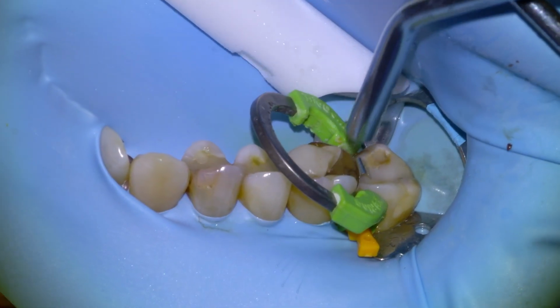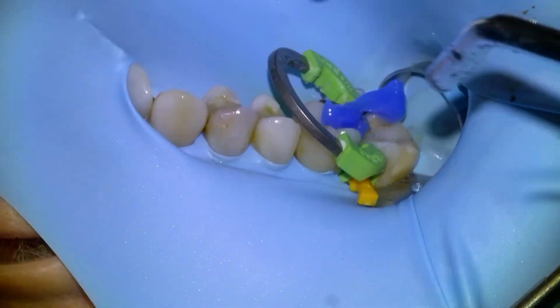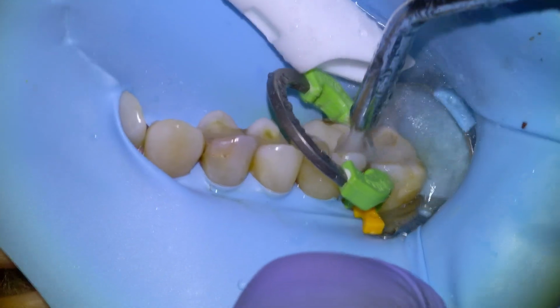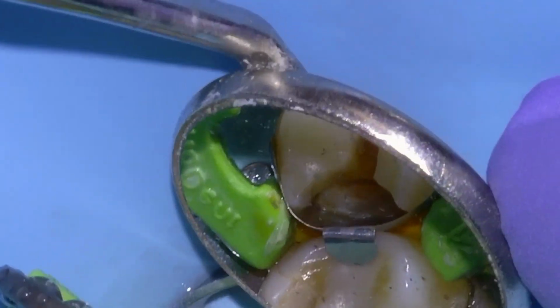Going to use Equia Forte, etch the tooth for 5 seconds. Had an air bubble in the syringe there. Got a little messy. Gonna rinse it off thoroughly. Good 10 or 15 seconds of rinsing the tooth. Dry it off mostly, and there we're happy. We're going to apply our restorative material.